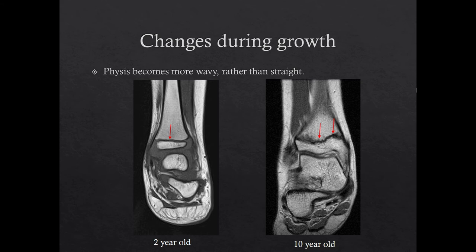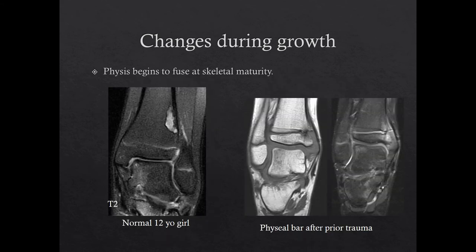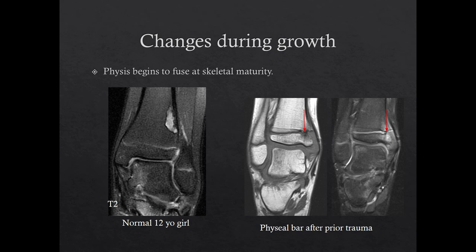This will represent the normal initial site of physeal fusion. Finally, a normal finding seen during growth is physeal fusion, which is a gradual process during adolescence. The physis may appear asymmetric, or you may not see the normal high T2 signal along the entire physis. Here is an example of normal beginning physeal fusion of the distal tibia in a 12-year-old girl, where the central medial aspect of the physis is less visible. This patient also has an incidental non-ossifying fibroma.